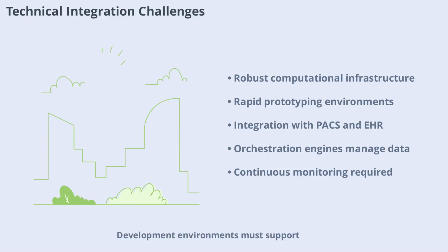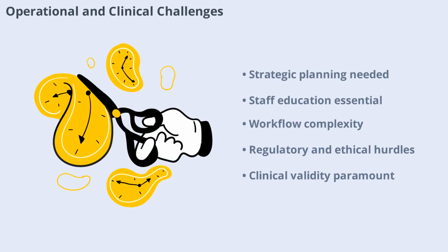Development environments must support rapid prototyping and interdisciplinary collaboration. Efficient integration with PACS and EHR systems is critical, but proprietary formats and lack of open tools pose challenges. Orchestration engines manage data routing, and continuous monitoring ensures safe, effective performance in clinical practice. Operational challenges include strategic planning, staff education, and managing radiologists' workloads. Variable adoption of standards and multiple AI result formats create workflow complexity.